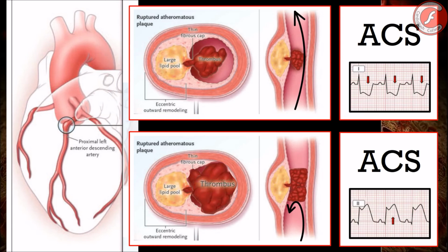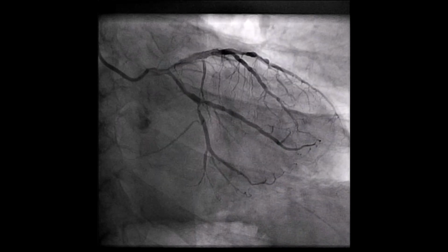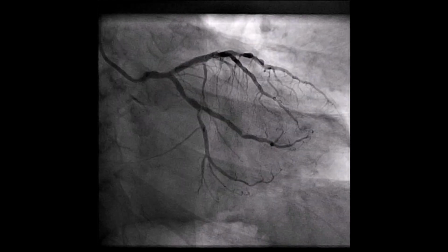Very simple. ST segment elevation myocardial infarction is the regular clinical manifestation of a complete blockage of a coronary artery and constitutes a cardiological emergency where every second counts. In this way, our main objective is to open the artery as soon as possible, whether using fibrinolysis or primary angioplasty. In this case, cardiac catheterization was performed, and, as you can see, there is a diffuse atheromatosis of the left coronary bed.